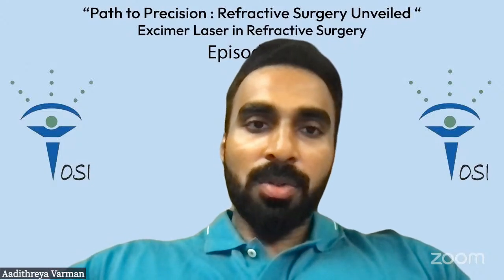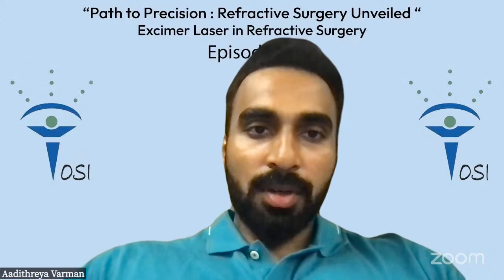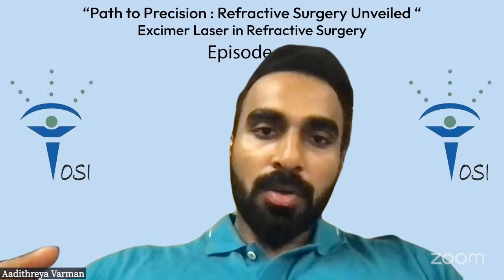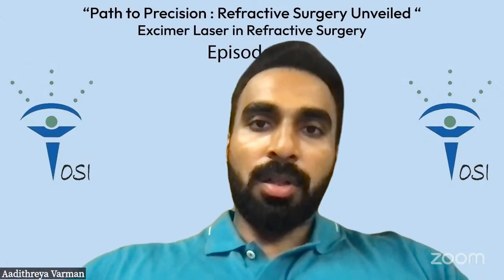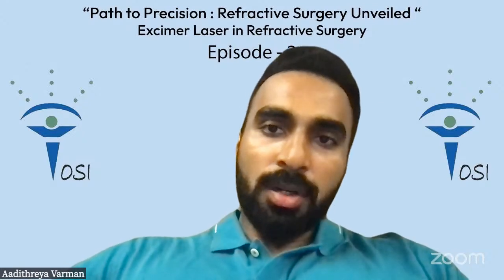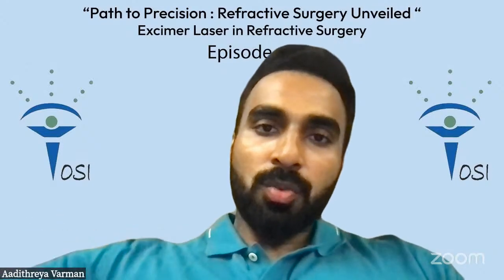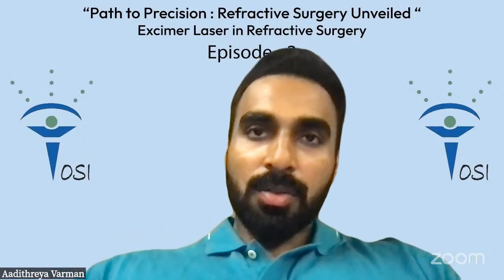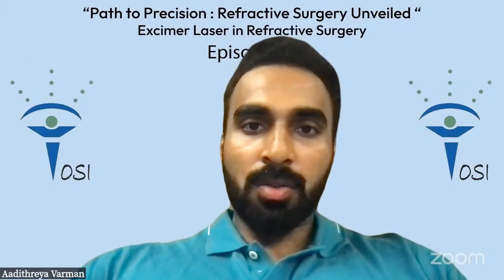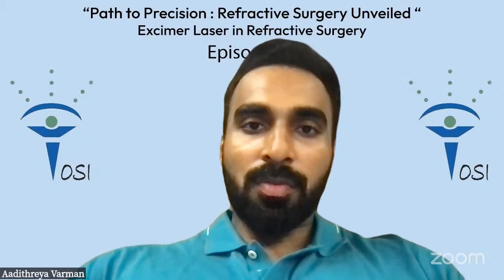So what we do is we just put the flap back. We use a 27 gauge cannula on a 5 ml syringe. You push out the fluid in a very forceful manner, that is, you overpressure it. You get the cannula under the flap, and in just one singular motion, you wash the flap out. That's it. In just one swipe. You don't need to do multiple swipes. Because of the Bernoulli principle, that itself will remove all the debris, and there's no need to overhydrate. If you don't overhydrate, you will not get any microfolds or flap crunch.